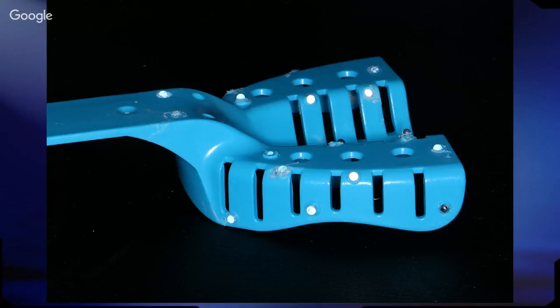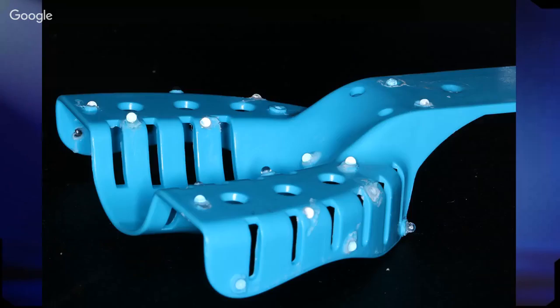You have the stick-on ones. So yeah, you can use the stick-on ones. Those work great as well. I find these stay on a little bit better because we're super gluing them to the tray. So what you do is, and our assistants do all of this for us, they're well versed in this technique. You can use a number 8 round burr and just drill some holes in the tray, and then glue the beads in.